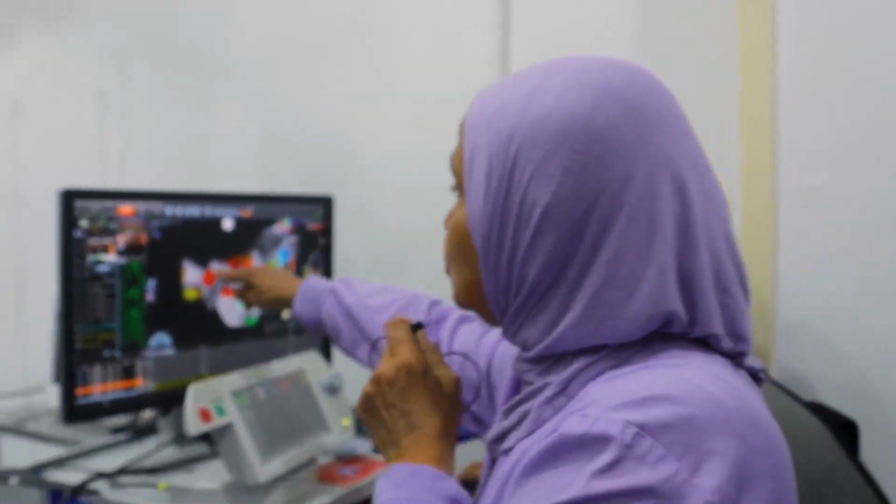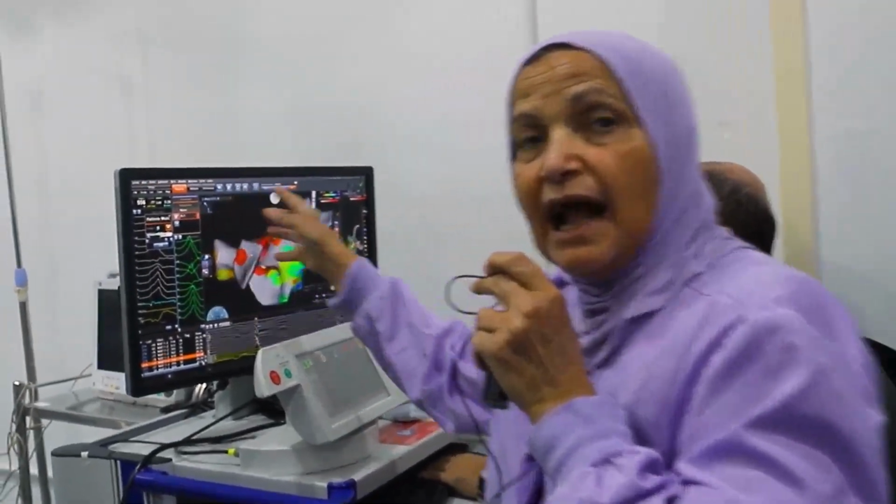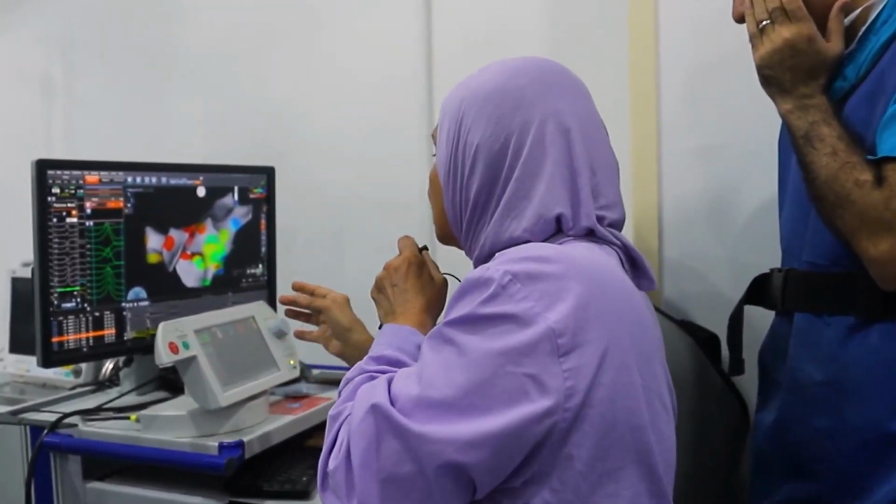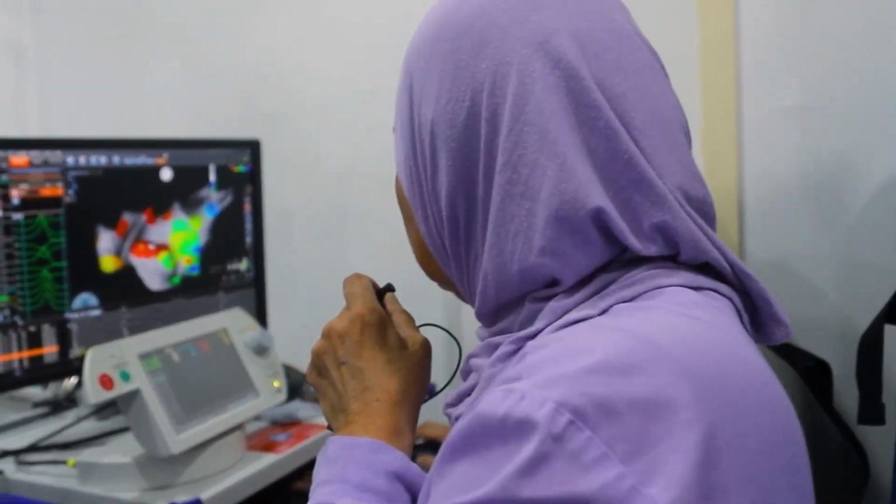First, in the carto we get this template, and very important to do template match. If you get the same PVC, you have to compare it with the template, because sometimes you get non-clinical PVCs, catheter induced, and even if you get catheter induced and you got it the same, so you are very close to the area, like pace mapping. We don't do pace mapping. So show us, Khalid, from the beginning.